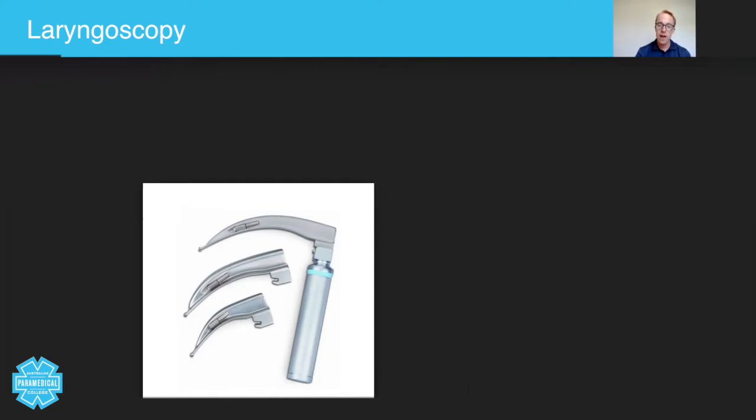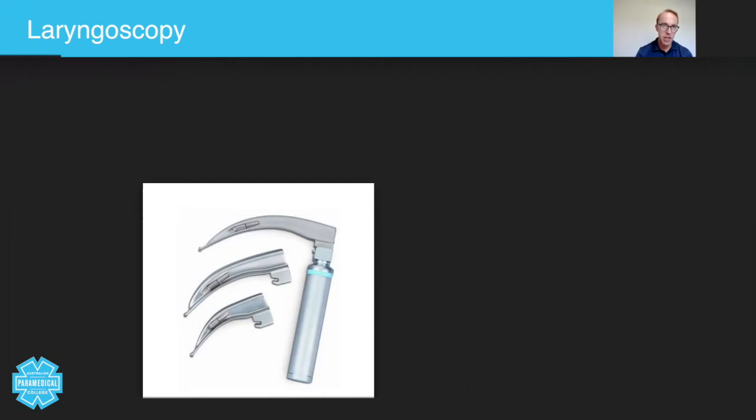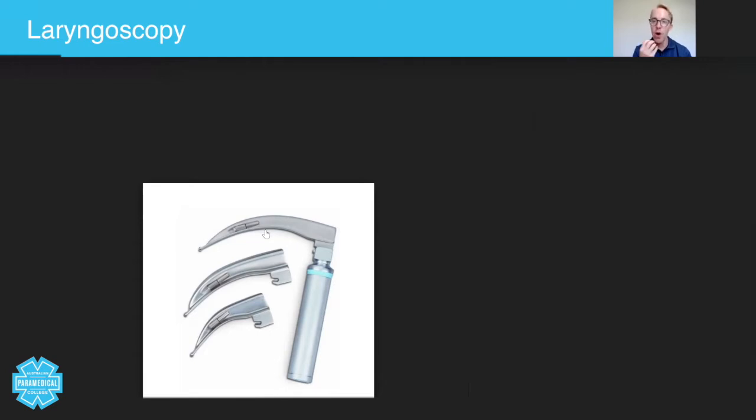So here you have a laryngoscope handle. Inside here you've got batteries. Here you have the laryngoscope blades. And notice how you've got this little light bulb here. As in this image here, you can see the light bulb. Because as you can imagine, the lower airways are quite dark.